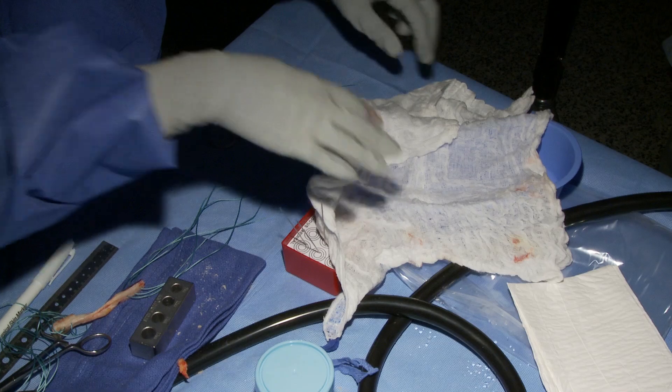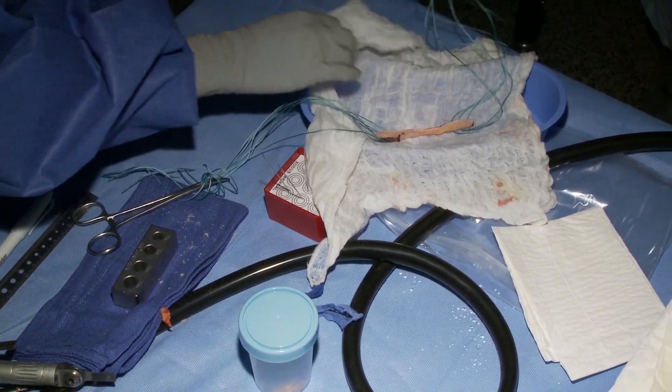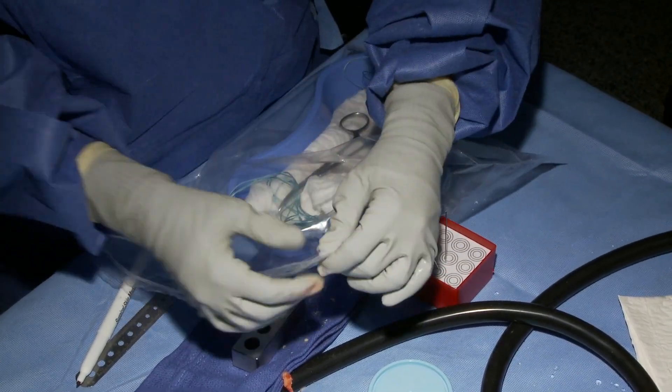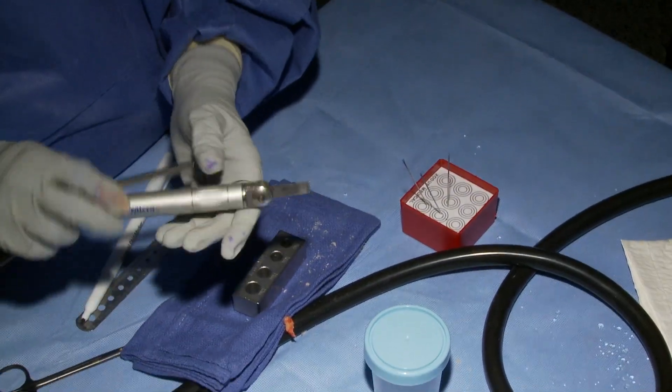Once the graft is finished, you place it in a moist lap and put it in a kidney basin wrapped up in a ziplock bag, and clamp it to the table so that it doesn't accidentally get knocked off. Then let the surgeon know that it's ready.